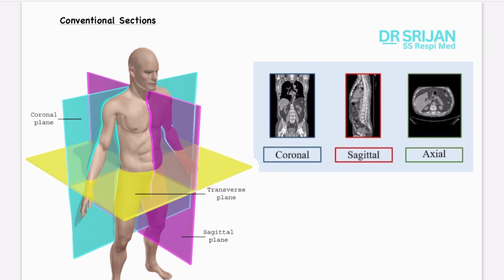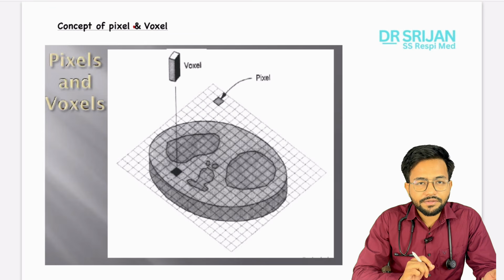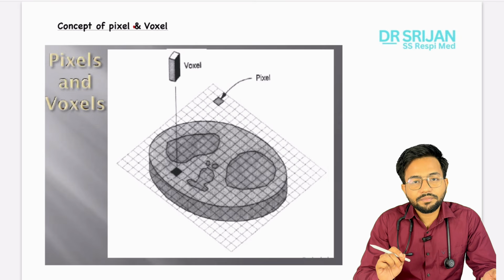So once we have spoken about the sections, now I want to speak very briefly about the concept of voxel. We all are aware of pixels.